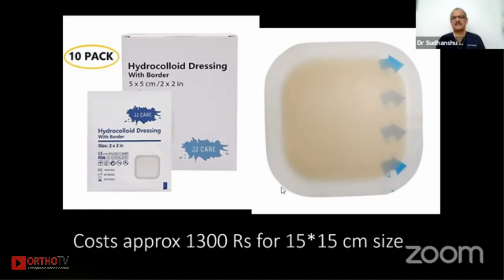Usually, when a surgical wound closes, the epithelium closes off in about 48 hours. So most of our hand sutured wounds, or we just keep them open in head and neck, over the chest also, from head and neck reconstruction, we keep them open from day one actually. But I suggest for the first 24 to 48 hours, keep a dressing. Rip it off, it will come off with that small crest of ooze that had occurred in the first 24 to 48 hours.